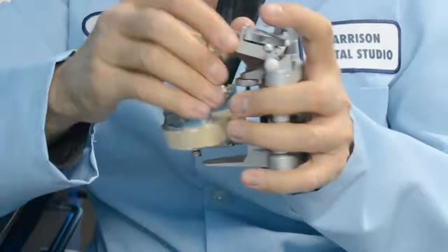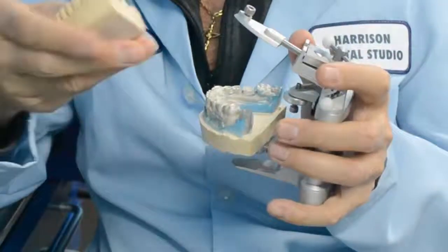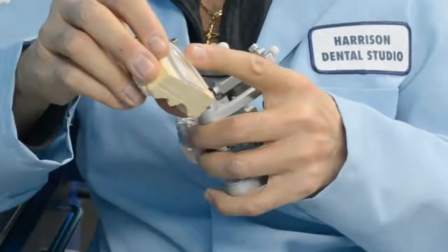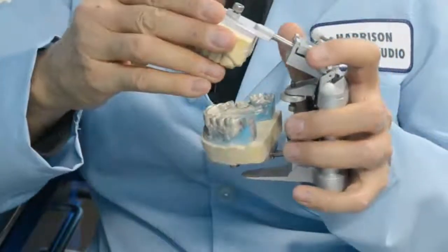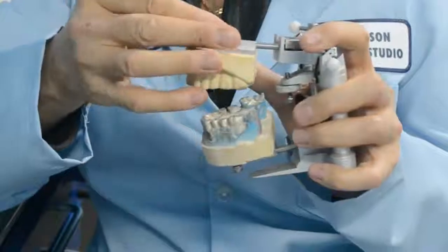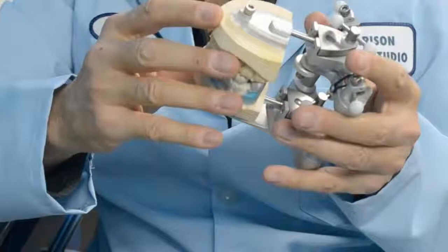The beautiful part that you can't do with a traditional articulator is you can take the model off, work off of the articulator, and put it back in the exact same position every single time. What used to take you 5 to 10 minutes with a traditional articulator might only take you 10 to 15 seconds. It's that fast.